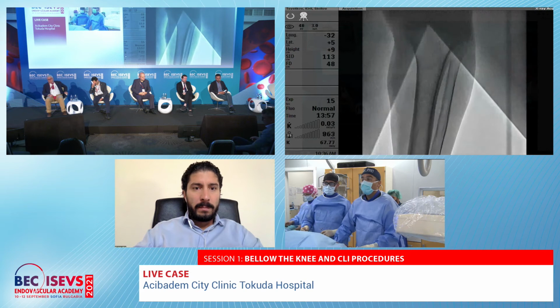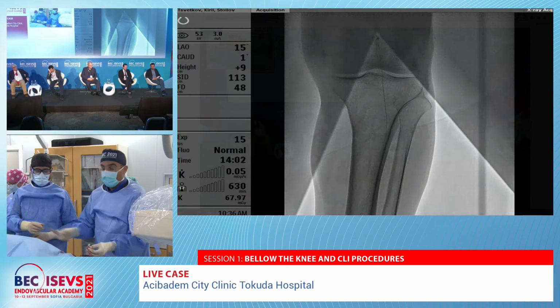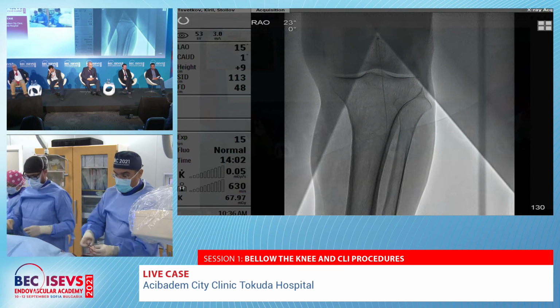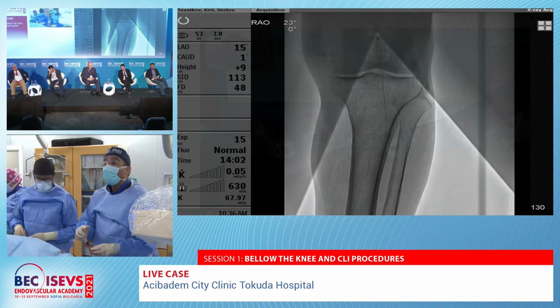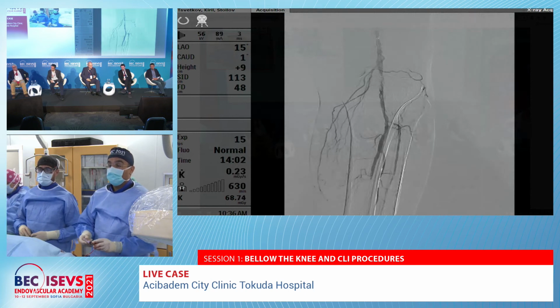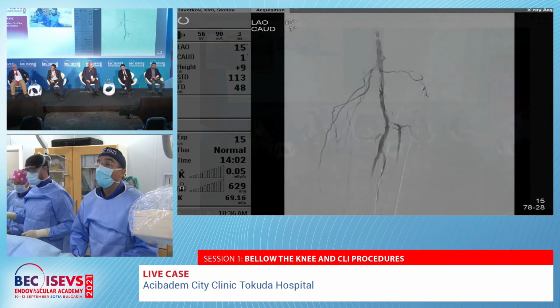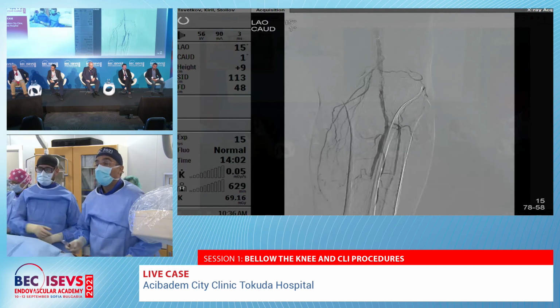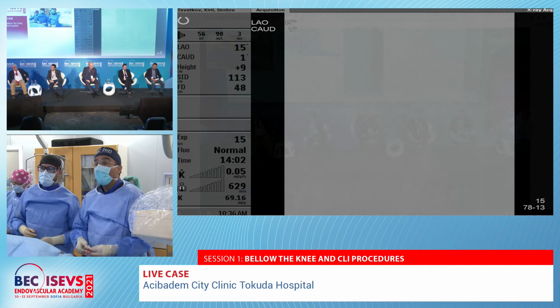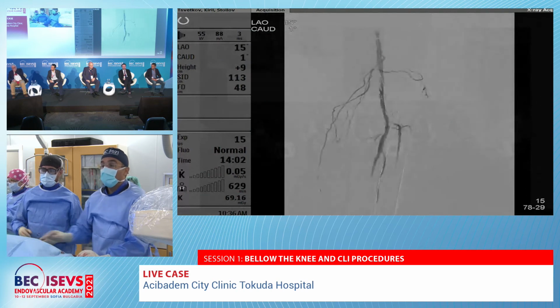If I have, after normal ballooning with the same actual size, no problem. After you balloon with a drug-coated balloon, the flow comes worse. And my personal experience was in accordance with the evidence that comes from randomized trials. So I am more cautious now using drug-coated balloons below the knee, but that's my personal experience.